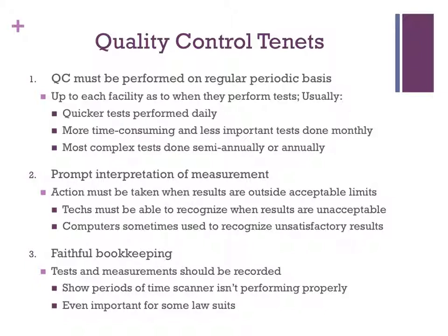Faithful bookkeeping is the third tenet or principle. Since time and effort are put into performing the test, then the test should be recorded, such as in a logbook, data form, or a computer for a reasonable amount of time. Usually this is done for the lifetime of the scanner. These recorded results will come in extra handy if the scanner seems to be malfunctioning on a recurrent basis.